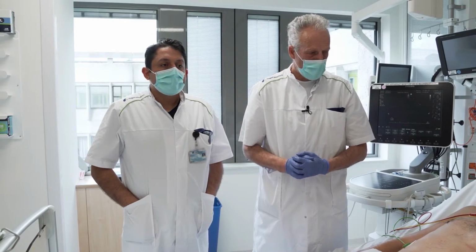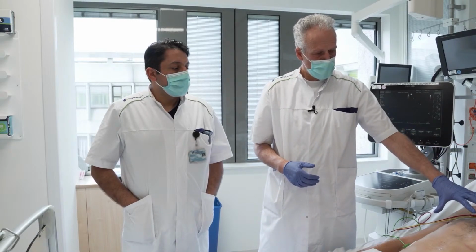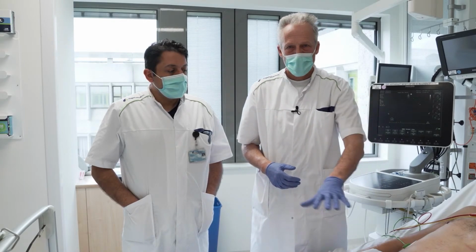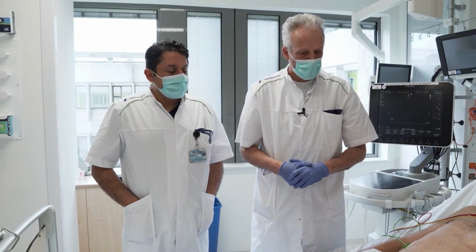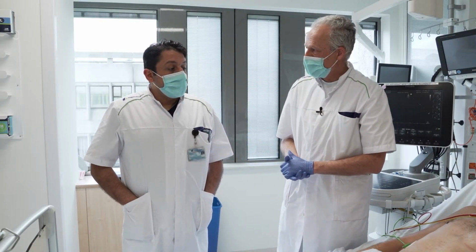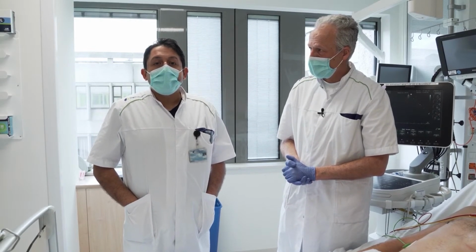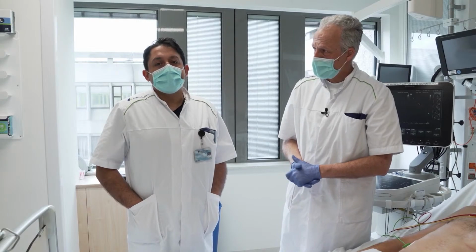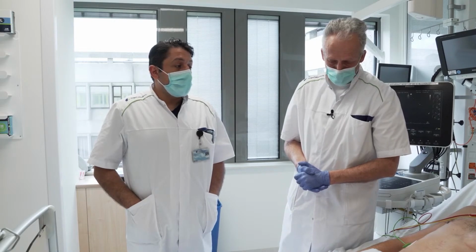Of course, in the patient in traumatic shock, you will usually have hemorrhage. It can be in the thorax cavity, the abdominal cavity, the pelvis or the long bones. For those, of course, you have to make your x-rays, but for the thorax and the abdominal cavity, this is a very useful diagnosticum. Sakir, do you have anything to add? Now we can conclude that by using echography we can come very far in our differential diagnosis in our very critically ill patients who are many times in shock, when you use your echography adequately.